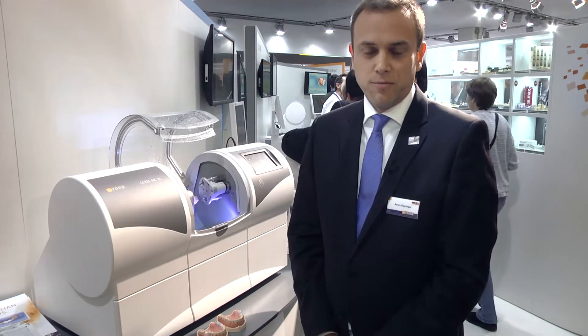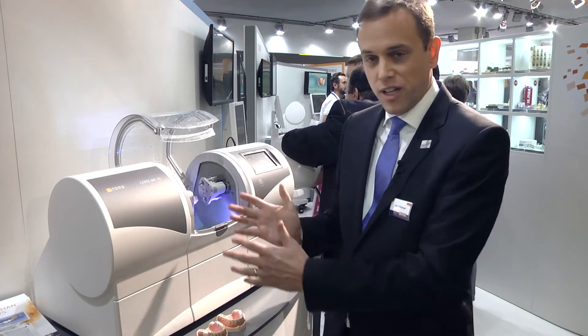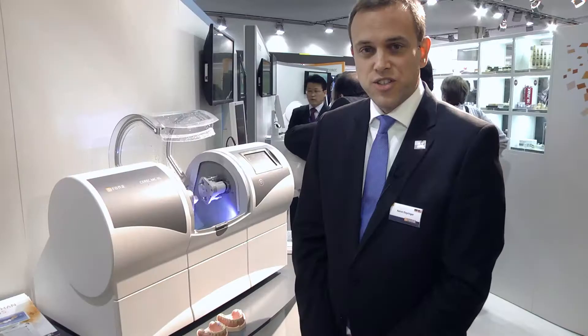Hello, my name is Aaron Debinger. I'm the product manager for our CEREC milling units. Welcome to the IDS 2015.